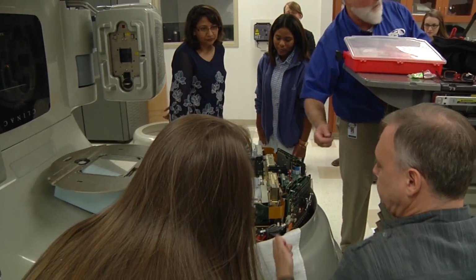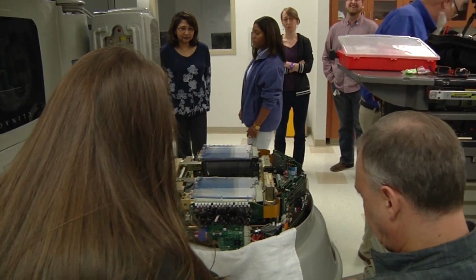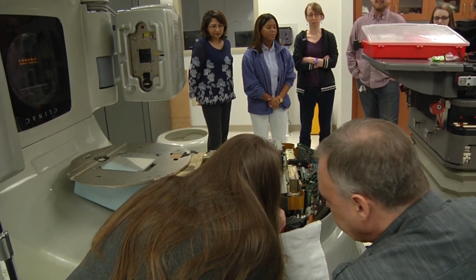Thank you, my friend. You're welcome. I'm gonna let you do it. So now we get to see how to collect one back out of there.